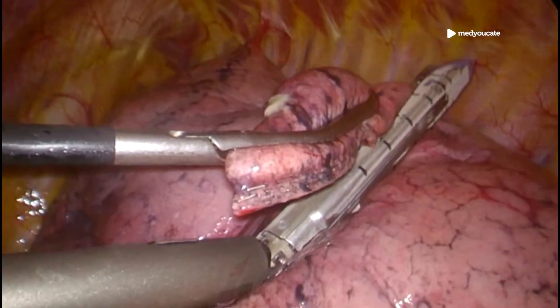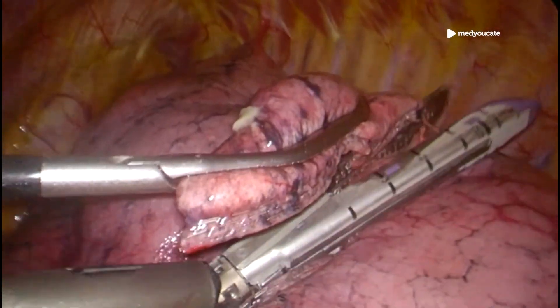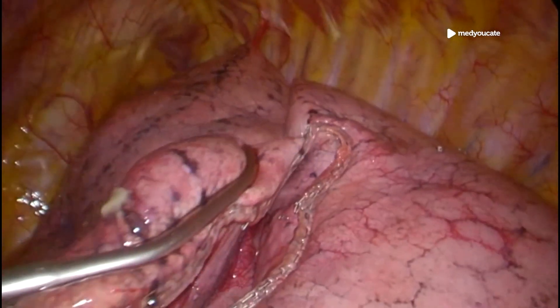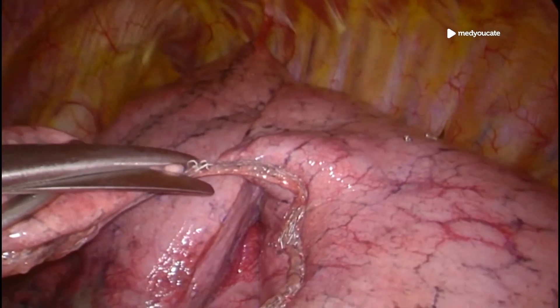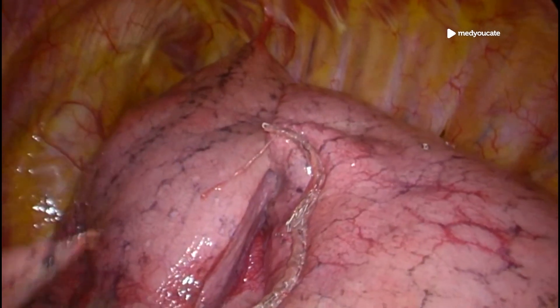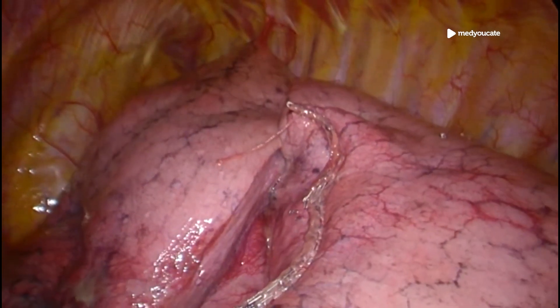In this case, we are talking about atypical lung resection because we are not orienting ourselves on anatomical lung segments. We see that this last tissue adhesion is divided with scissors.